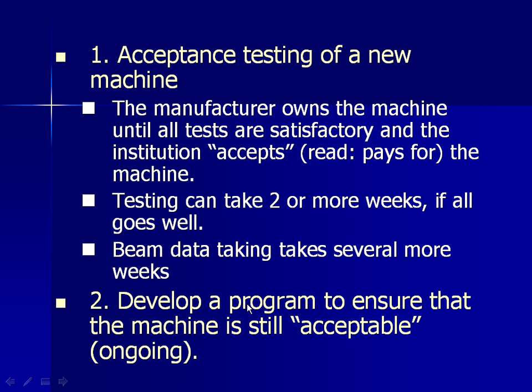How would it happen that during commissioning the new machine, it would be miscalibrated? It seems like there are multiple checks and balances. The company would have their physicists manage it, and then with this. I'm not saying it hasn't happened here, but like that other example you provided.